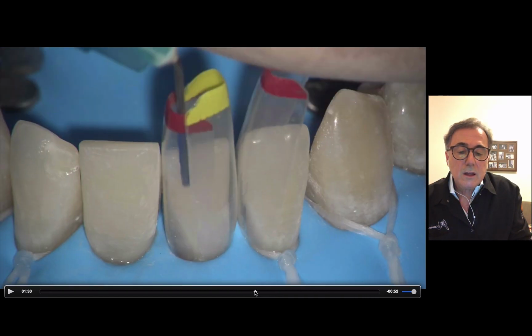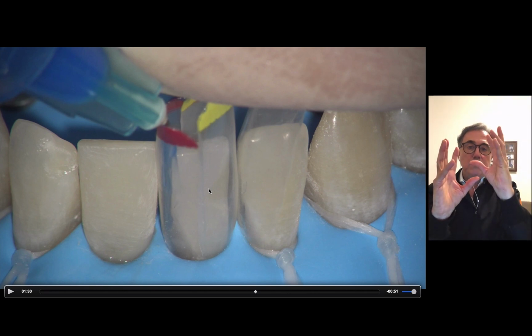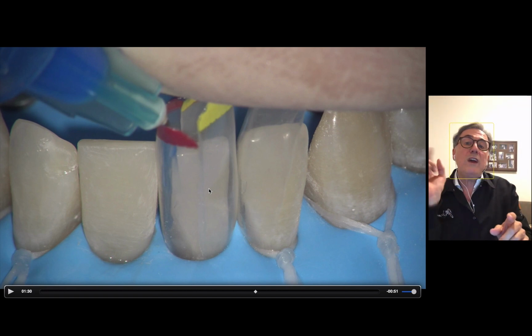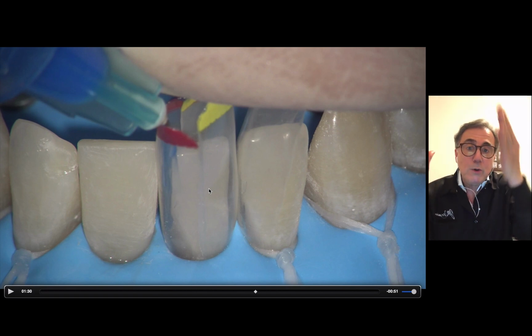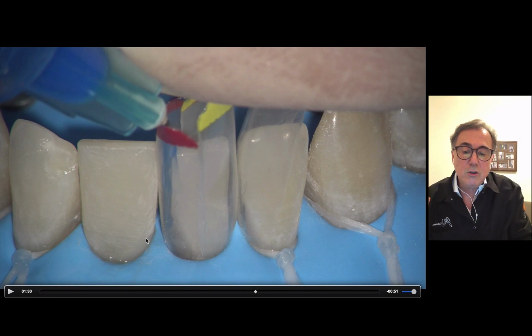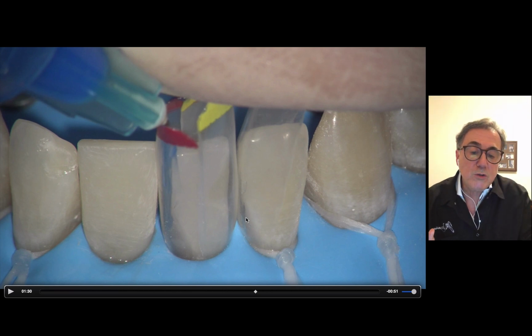Okay, see? When we start the second tooth, we placed those two matrices, mesial and distal in this case. And then we placed an auxiliary matrix in the other tooth, but not in the tooth we had already restored. Why? Because we already have the right contour of that restoration, right over here. So you don't need to put an extra matrix there. But in this tooth that we haven't restored yet, we do it so that we can have the right distribution of this space right over here. Okay, so let's go on.